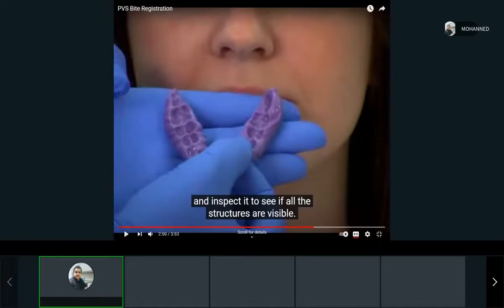I don't know if you've used these guns to seal something, right? And when they dry, the caulking kind of sets, because it's also silicone, right? So it will set and you'll feel it's rubbery. This is a little bit more rigid, but again, it's like rubber.